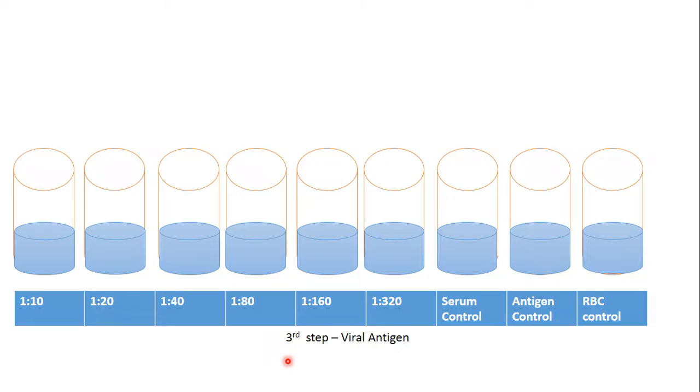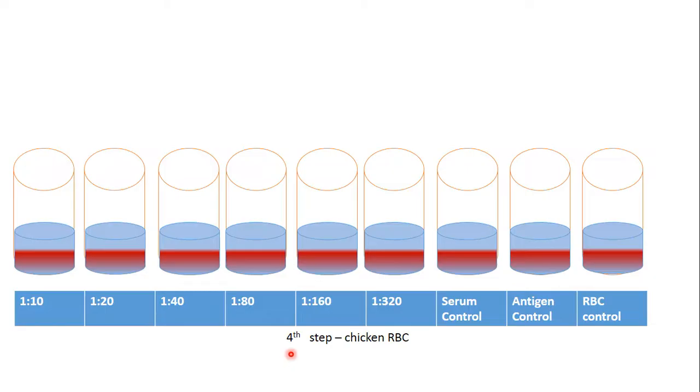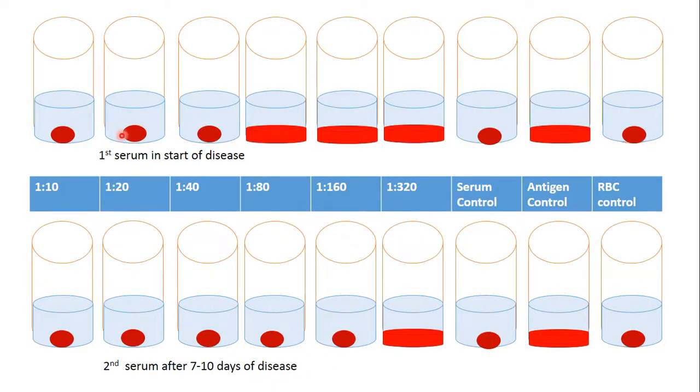All steps with the control tubes were repeated. The fourth step: we add chicken RBC and check results. Now we can see what is in the first line of tubes.